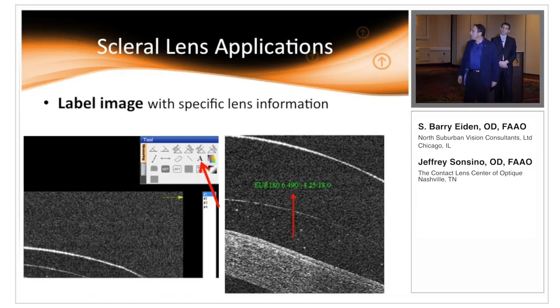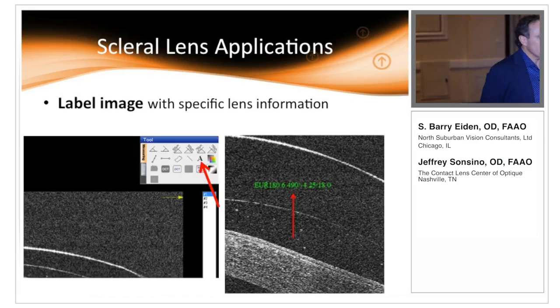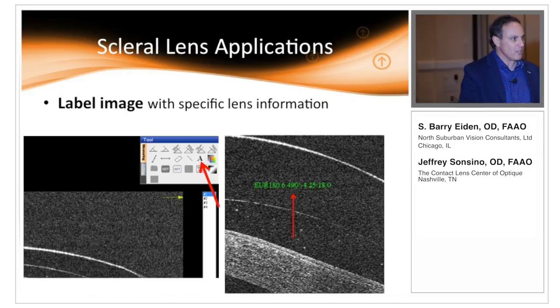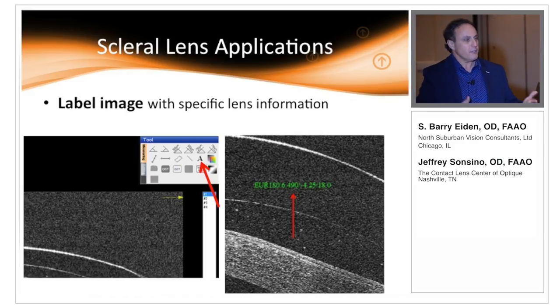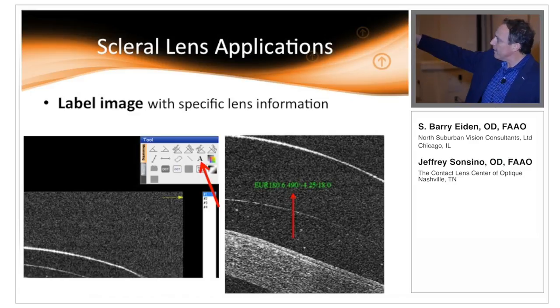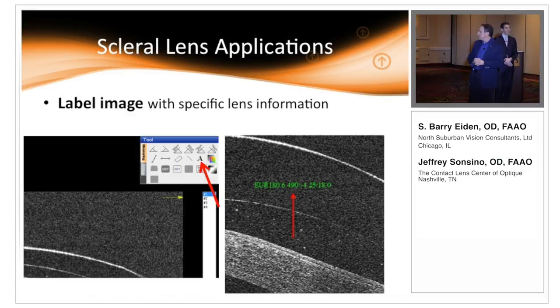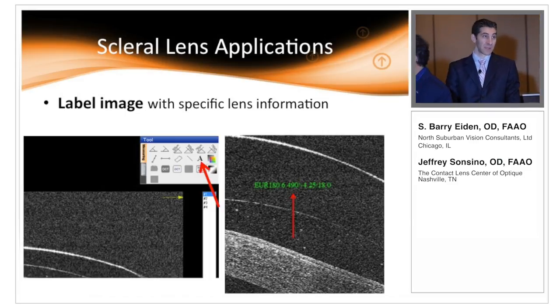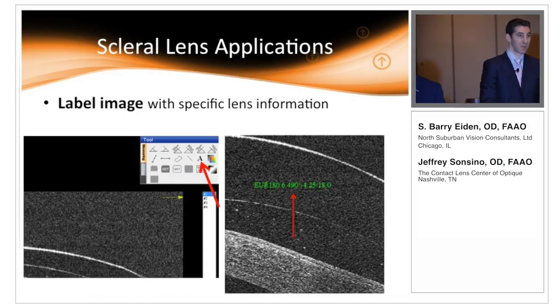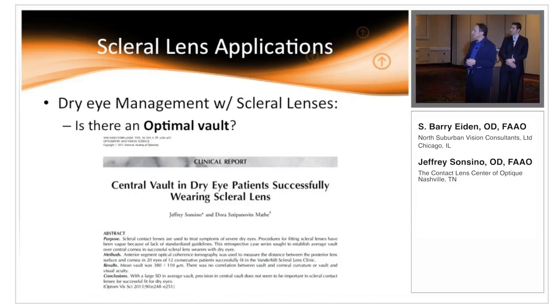You can obviously use that same tool to measure lesions in the cornea. This is really important: during a diagnostic evaluation you're putting a variety of lenses with different parameters on the eyes, and you often can't remember which lens was on the eye. There's a tool in OptiView — shown by that little letter A — that allows you to type in key identifying elements like design, vault, diameter. My techs are under strict instructions that every OCT taken is labeled, especially since during a diagnostic fitting I may put three, four, or five lenses on a patient.